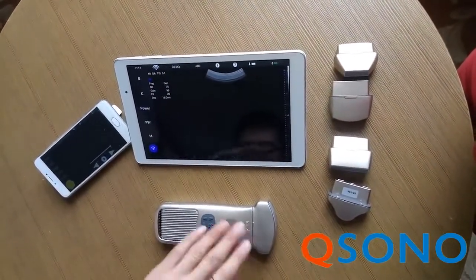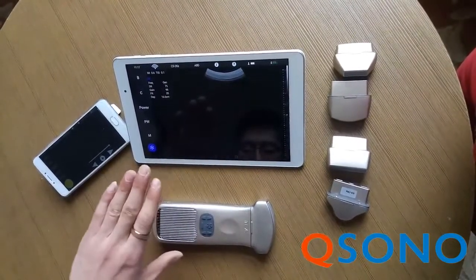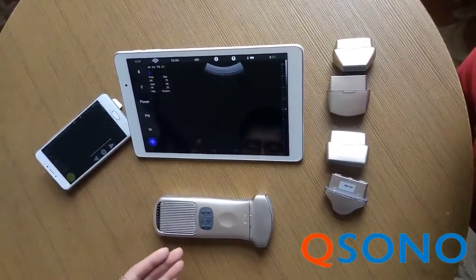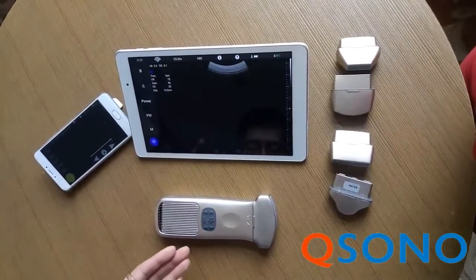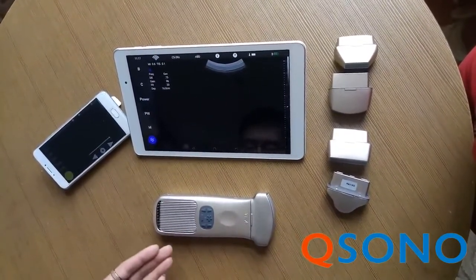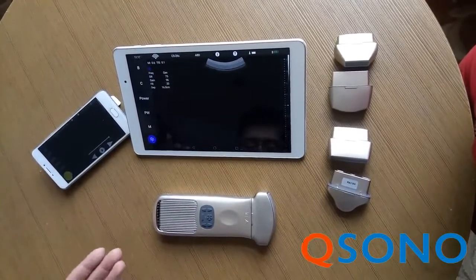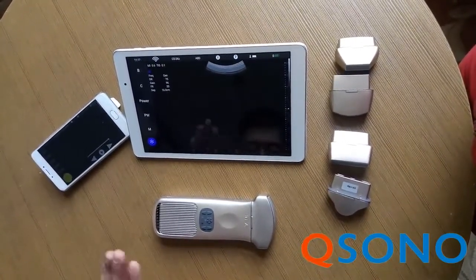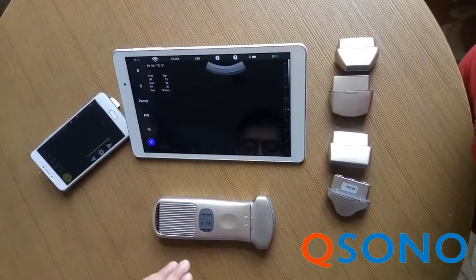And the long continuous scan time — it can provide about 6 to 8 hours of continuous scan time. No need for an adapter or spare battery during the examination. And it will never overheat because of the low power consumption design.